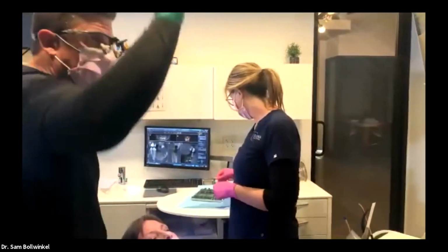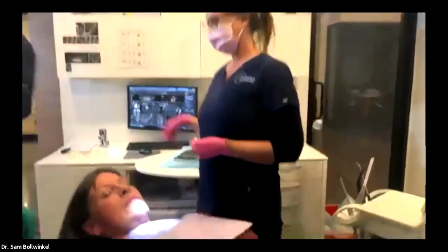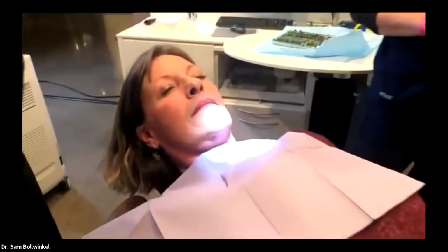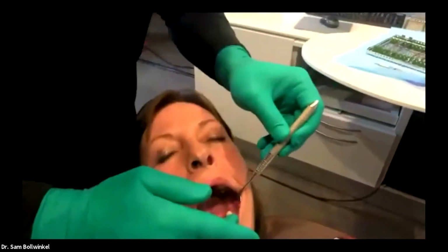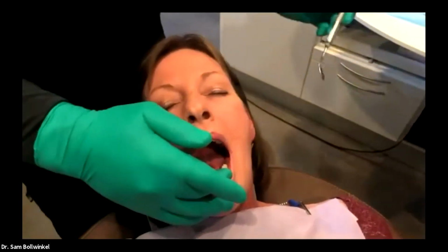So we're going to turn this off. Can my camera guy get in close there? I'm going to move some things. The fun part about working live is getting camera shots so you guys can see what we're doing, but then we get to see what we're doing as well. So let me add, we've already given a little bit of anesthetic to Carrie. Go ahead and open, sweetie, good. Let me add just a little bit more to that ridge.